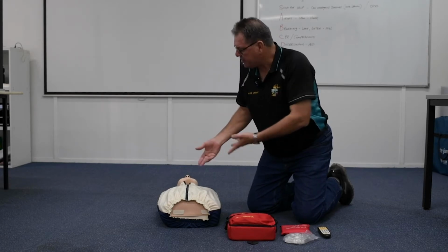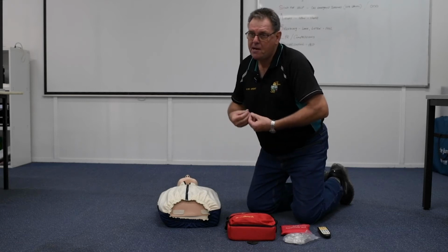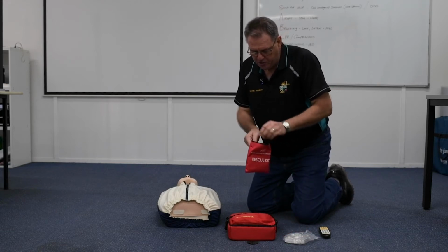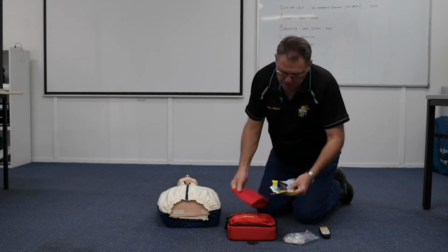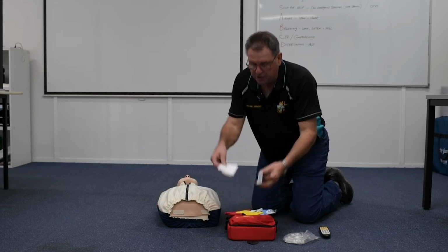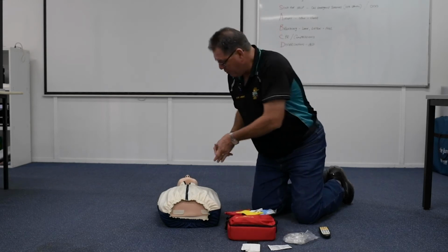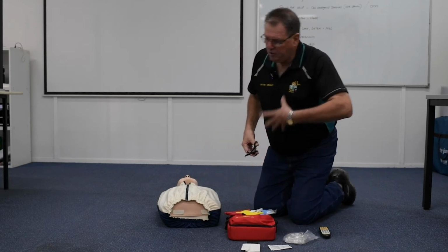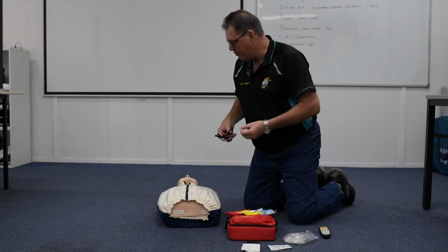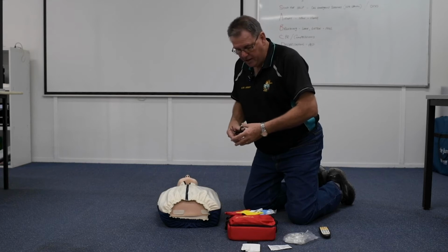It will then ask us to go through and remove all clothing. If you've got a female patient, the bra needs to come off. With your AED, we do have a little rescue kit with some items in this. One of those is wipes, to be able to wipe the chest if the chest is wet. We've got shears that we can cut through the clothing and make sure we can cut through the bra if we've got a female patient. The bra needs to come off because it's got wire in it, it's metal, and it can arc.